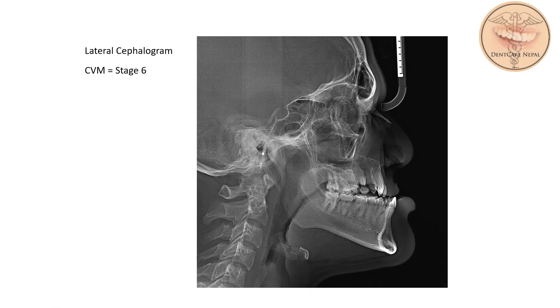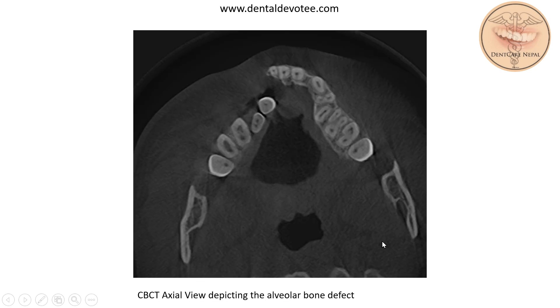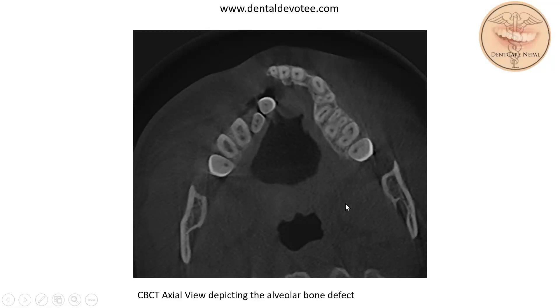This is the lateral cephalogram of the patient with CVM stage 6. We can see a concave profile — the upper lips are retrusive and lower lips are protrusive, with a deficient maxilla and mandibular axis. This is the CBCT image in axial view, where the cleft on the right side and alveolar bone defect is clearly present.